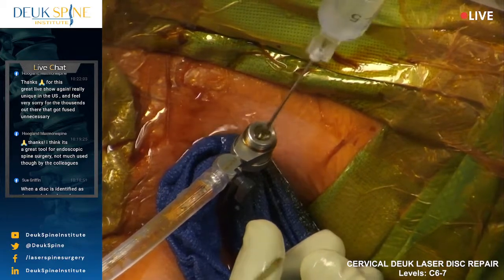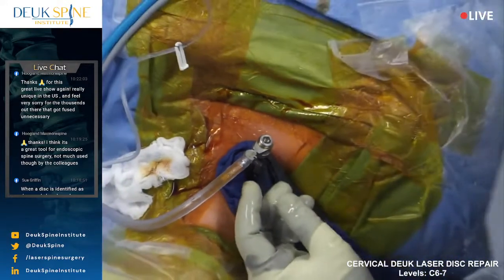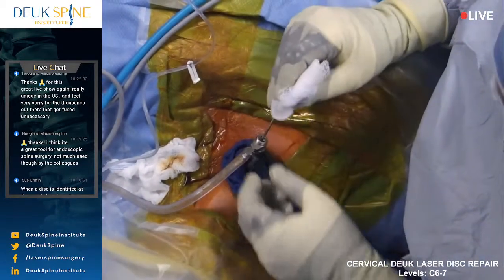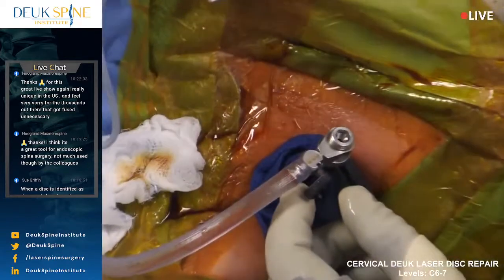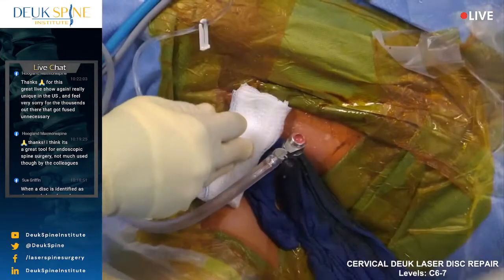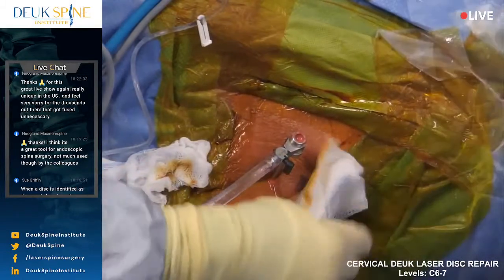So I was able to get down safely to the C6, bottom of the C6 vertebral body, where there was a bone spur curving down over the front of the disc, but not completely blocking the disc at all. It still left an access underneath the bone spur, but I was able to get the needle to that, then the guide wire, and then I put the dilator on that bone spur, and I just marched the dilator down a few millimeters until I was over the actual opening in the disc in the front.